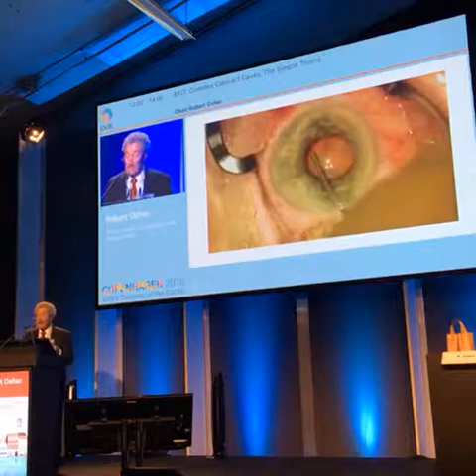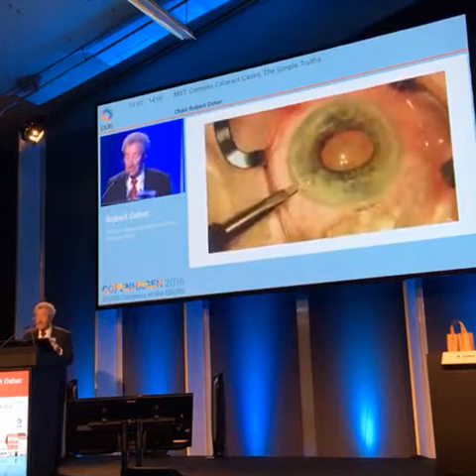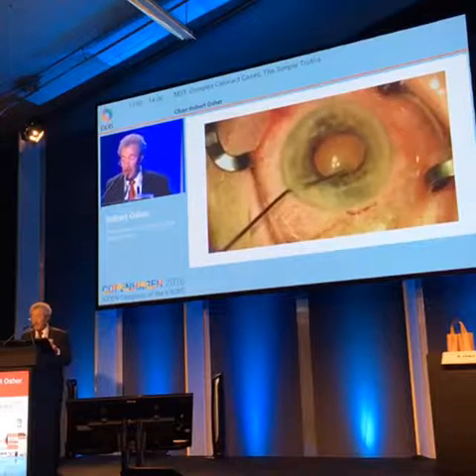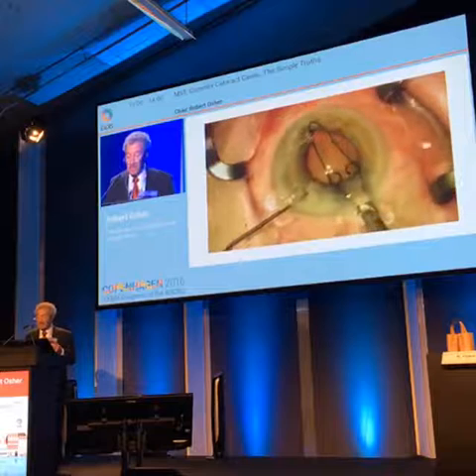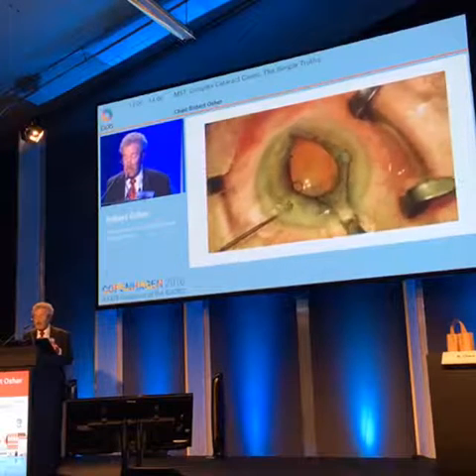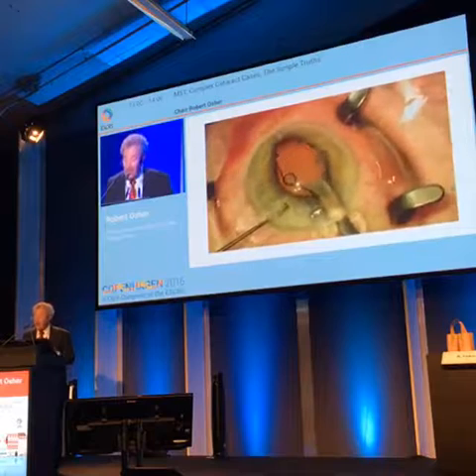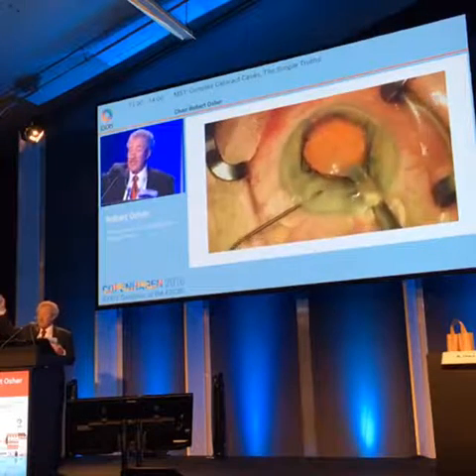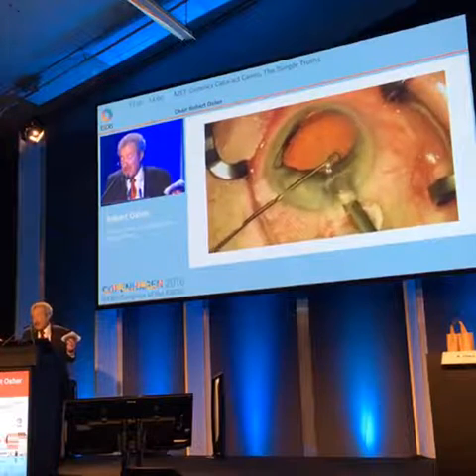I create the space by mannitol and by digital massage, I lift the iris off the anterior capsule, and then I put in the ring. And look, see, I missed that. It's okay. There is no Olympic judge penalizing me for missing the scroll. I just take a second try.